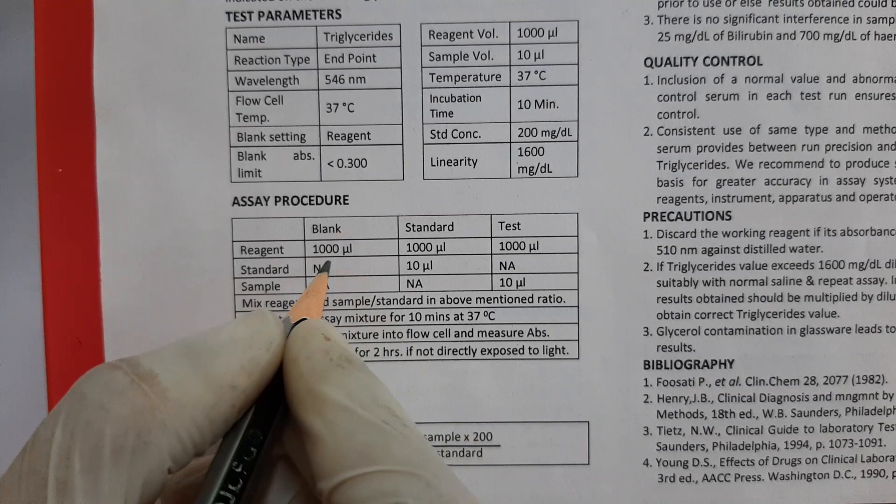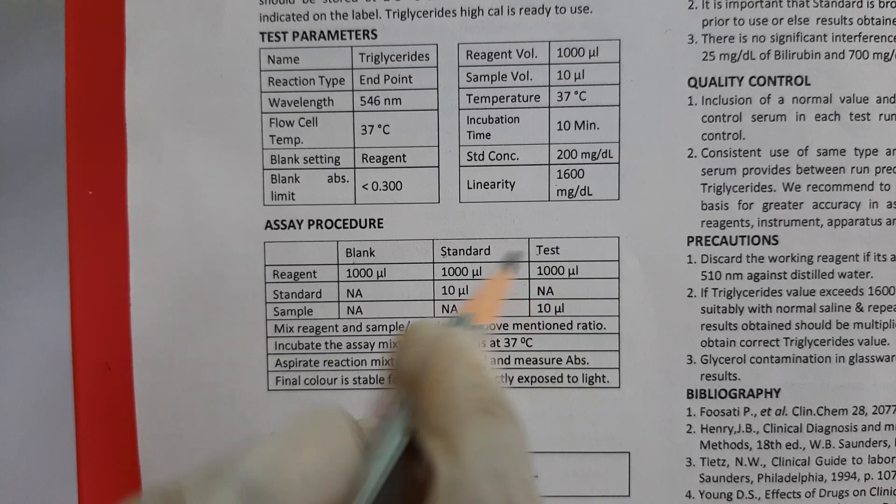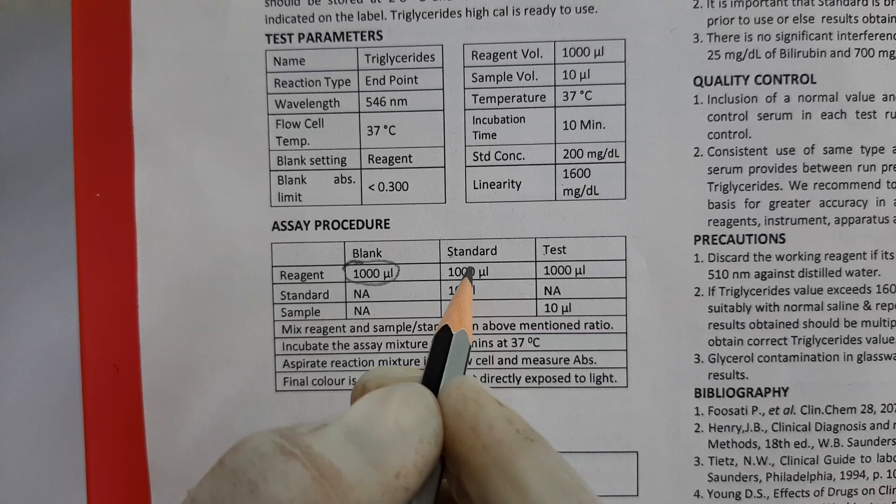As per the protocol, we need to take 3 different tubes: one for blank, one for standard, and one for test. In the first tube of blank, we will take 1000 µL of reagent only.